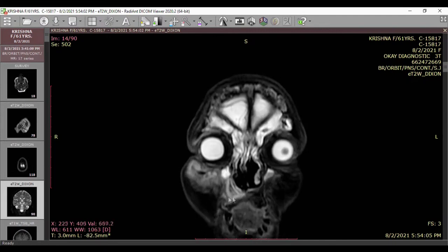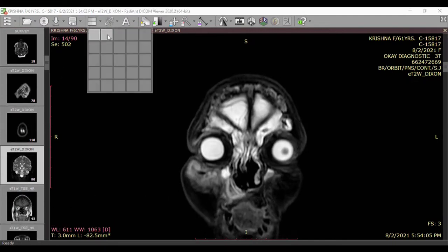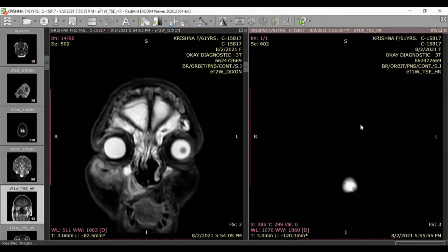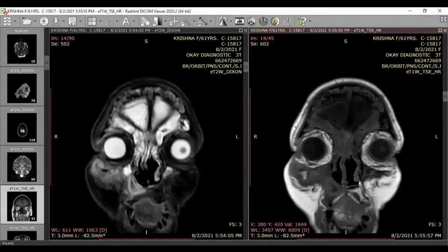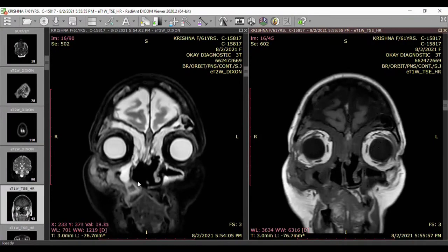See the inflammation, and if you bring the T1 weighted together, you will see. See the marrow on the normal side? Can you see the marrow on T1? Yes, sir. Normal marrow on T1, and the opposite side marrow is replaced by infection, which you see here as a hyperintensity on T2. It confirms your diagnosis. You don't need anything else. It is so clear.